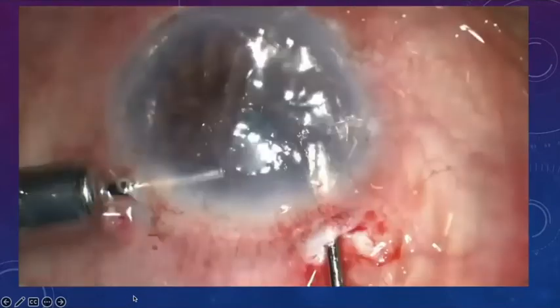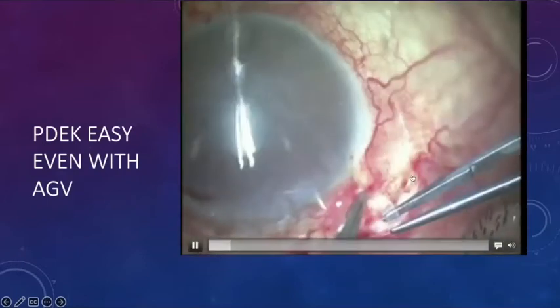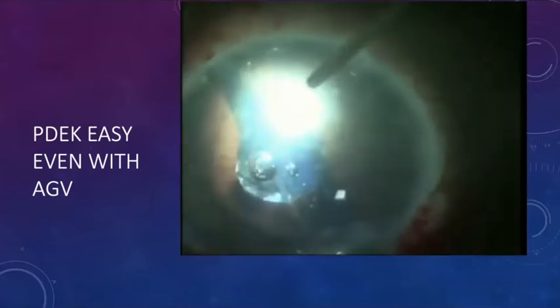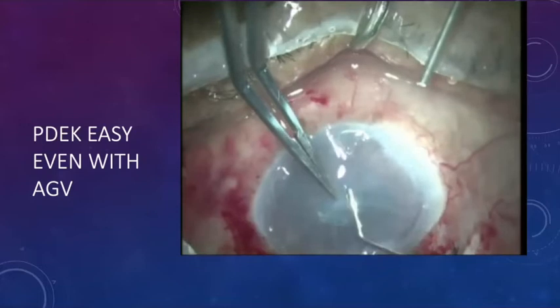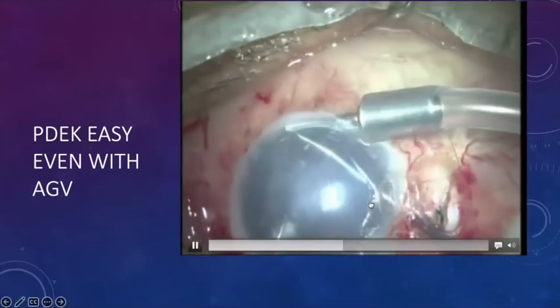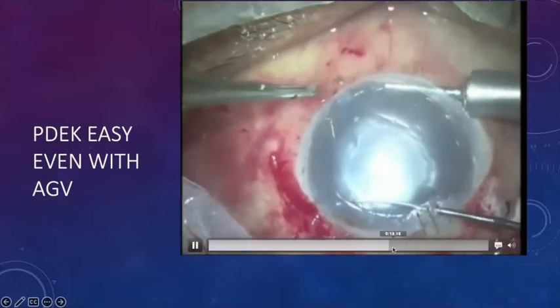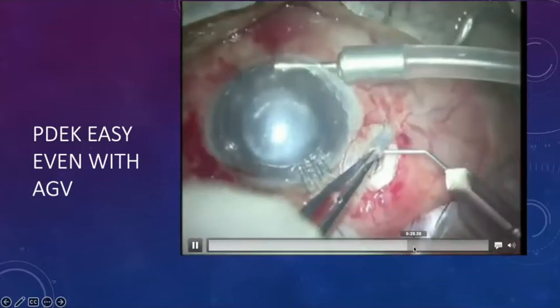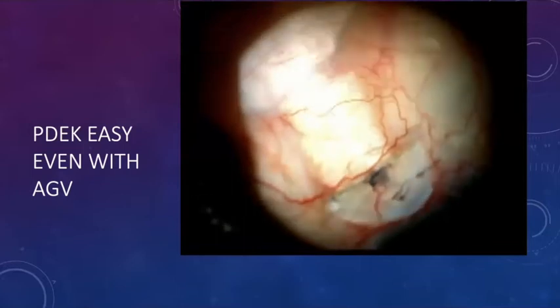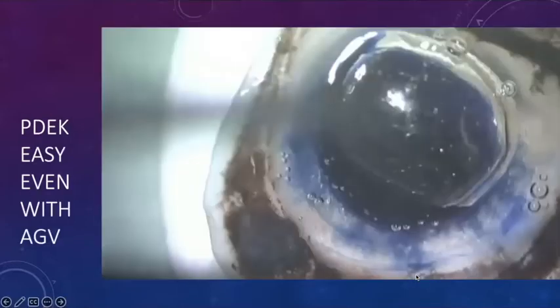Here's, oh, I think that's the same video again, sorry. PDEK can be done even with Ahmed glaucoma valves. This is a valve that was placed in the anterior chamber. I personally never like to place valves in the anterior chamber because I think all corneal surgeons will agree that with time they do inevitably lead to corneal damage. So I have repositioned it into the posterior chamber behind the iris, but in front of the intraocular lens. And we've got the graft in. Since I'm using air pump assisted PDEK, the graft actually attaches even before the surgery is over. That's a big advantage because even in these AGV cases, you do not have postoperative graft detachment.